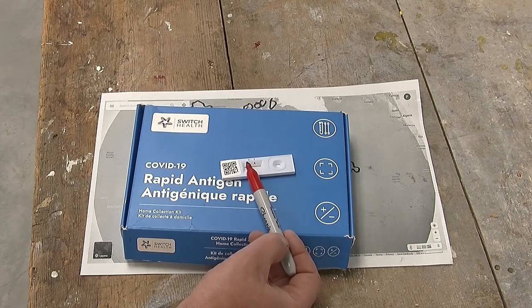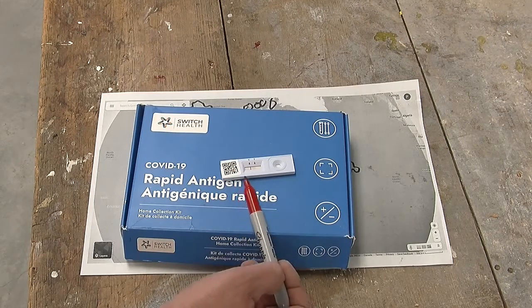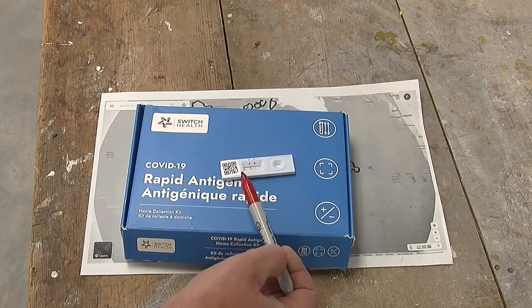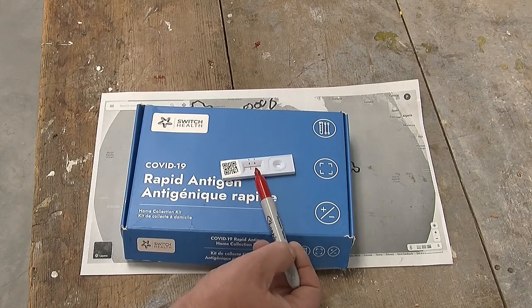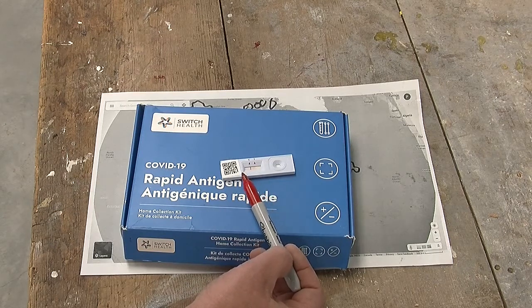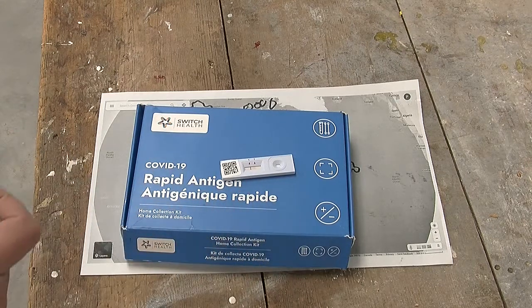I'm guessing that C was chosen to make these test kits well before COVID came along, and was used to just signify control. Anyway, it is the type of thing when you do the test and the line appears and it's next to C, you go, oh my gosh, I've got COVID, and of course you don't. So poor human interface design, but it's also probably a case of it works, and the key thing was to rush these tests out as opposed to try and make the human interface better, and that's often the name of the game in making something successful.